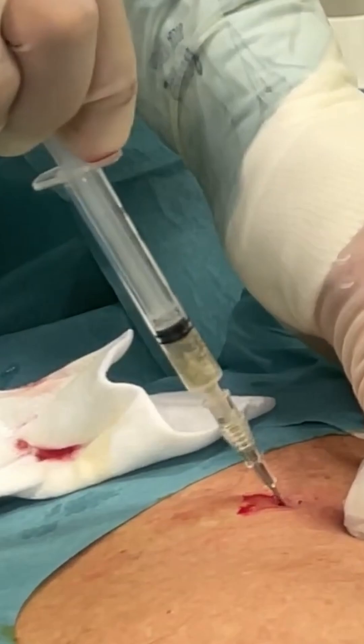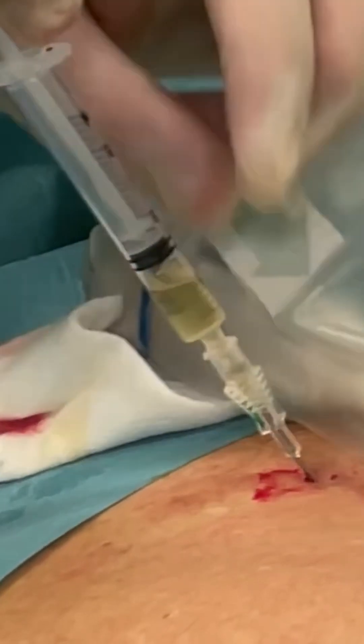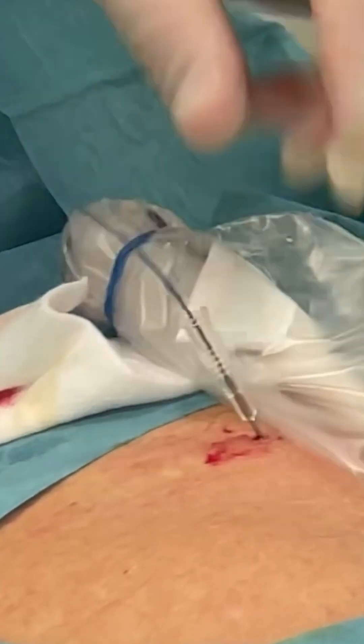Note the very clear puncture of the pericardium and visually confirm that the cannula enters the black void that is the effusion, away from the beating heart. With the cannula in place, insert the guide wire.